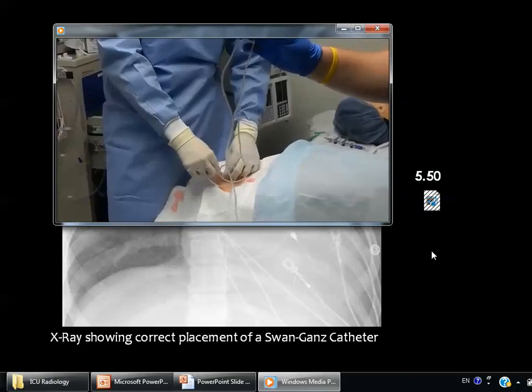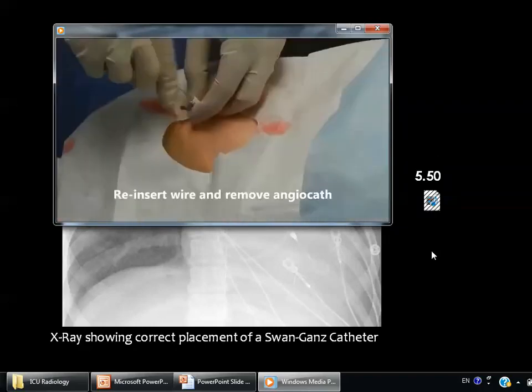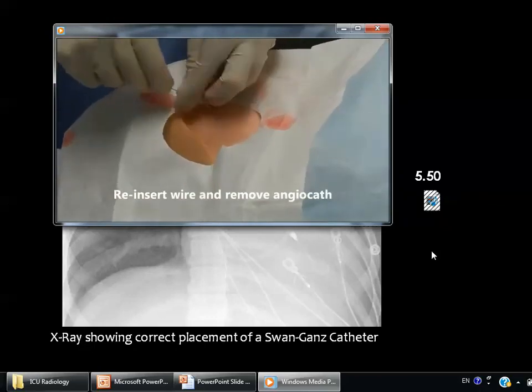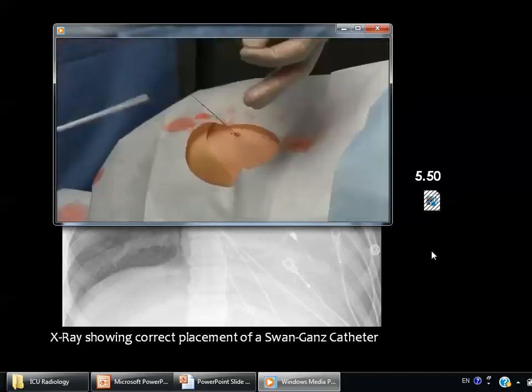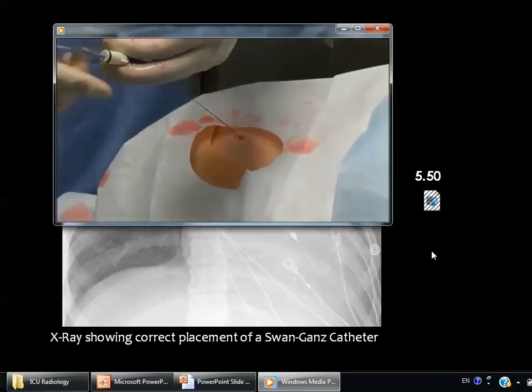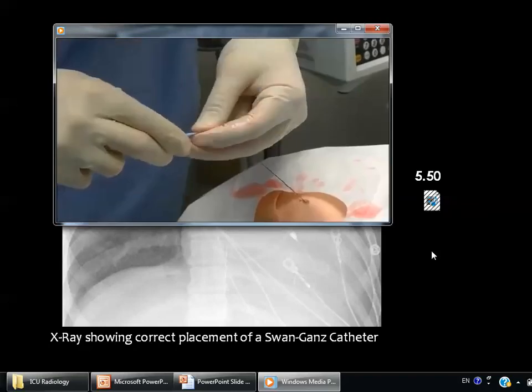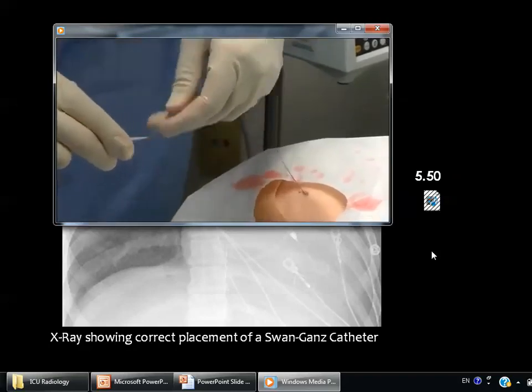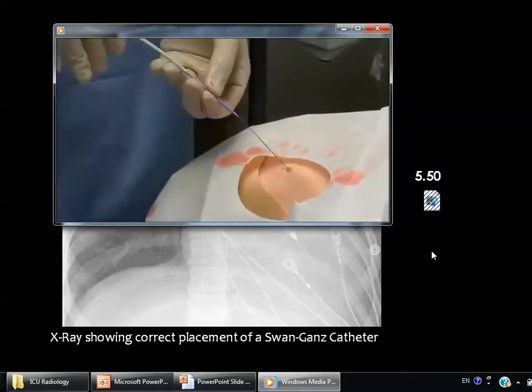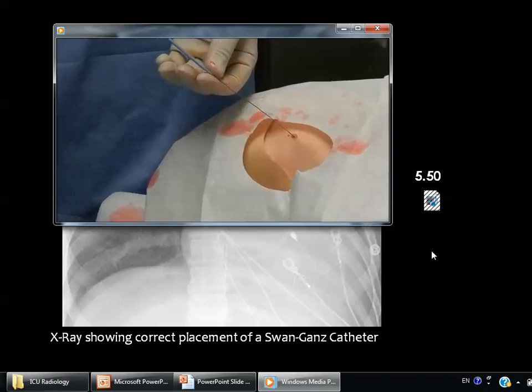I can now take this off. So I take that off. Go ahead and get rid of that for me. Now that this wire is back in, it's time to float our central catheter. So I'm going to load my cordis here with the dilator. And then when it gets to right here, there's a couple of points that I want to make.